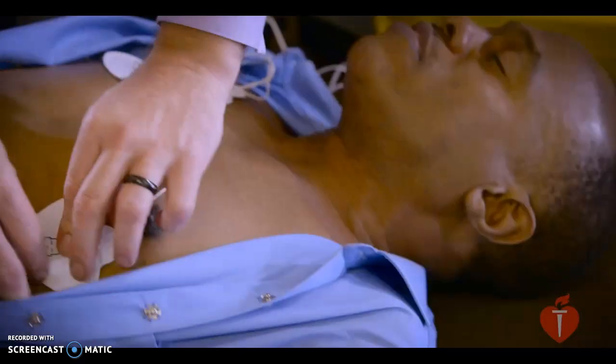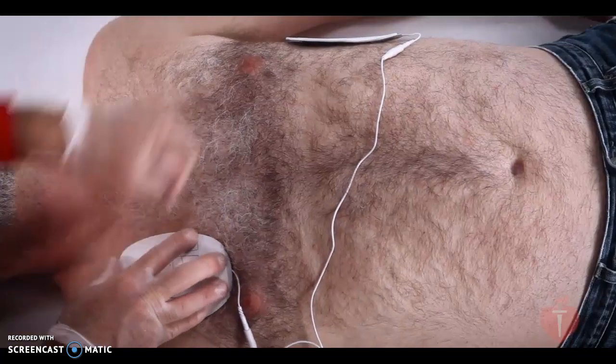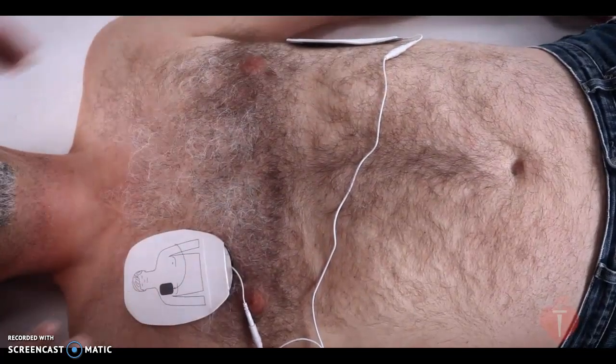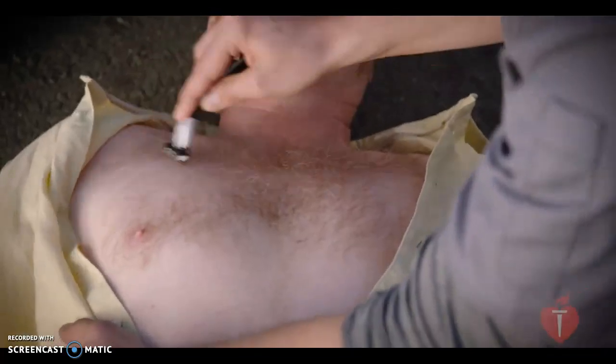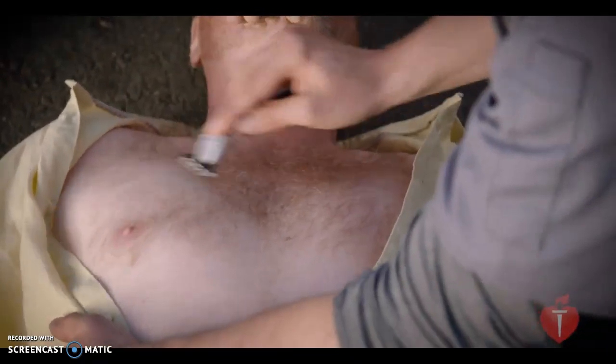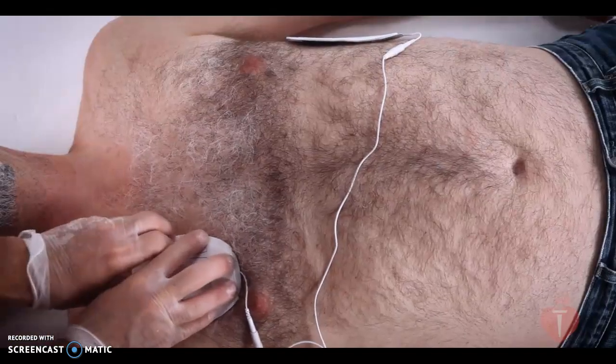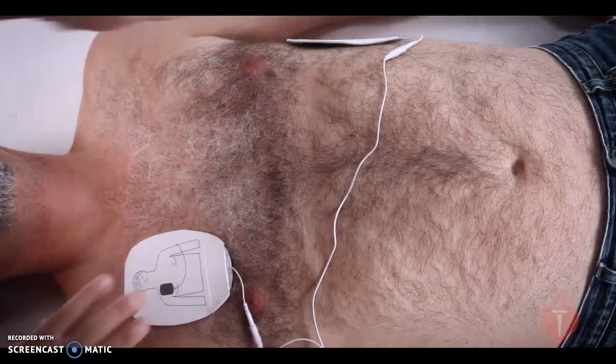You'll need to consider a few special situations when using an AED. First, if the victim has hair on his chest, the hair may prevent the pads from sticking. If your AED has only one set of pads, a razor should be included. You can use the razor to quickly shave the area and then apply the pads. If your AED has two sets of adult pads, you can apply one set to the hairy chest.